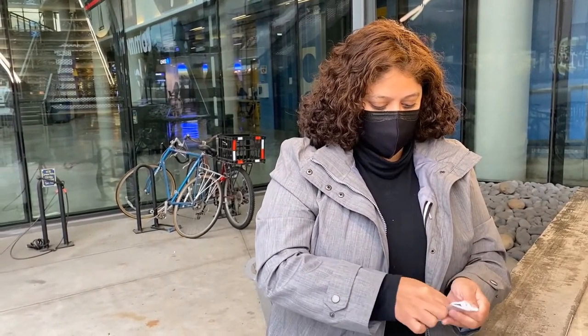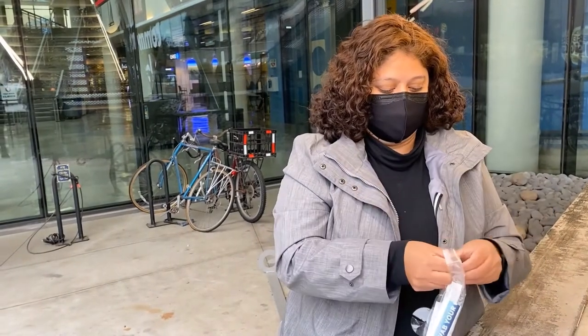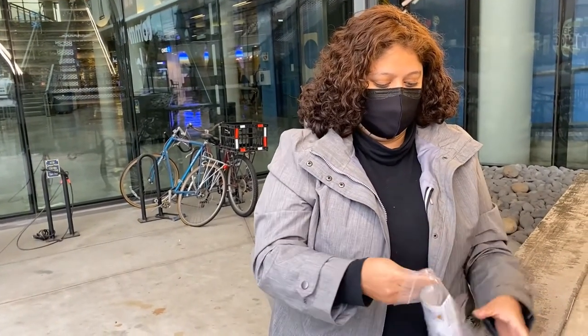I come outside to go ahead and take the test. Make sure you pick an outside location. Remember that your first test must be a provider-administered test before you can use a vending machine.